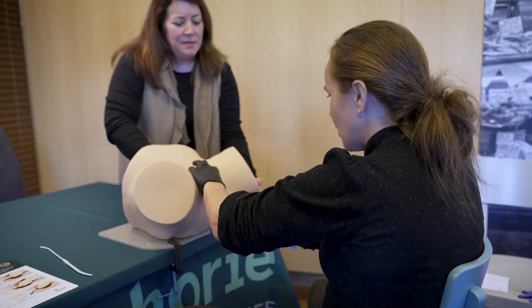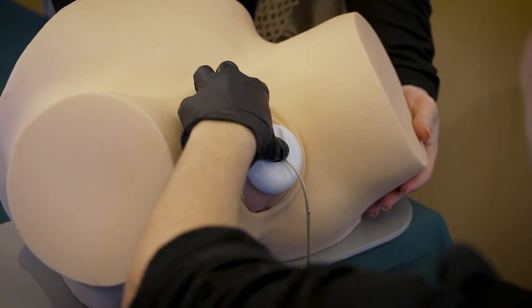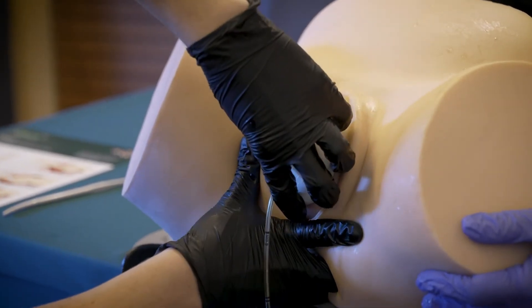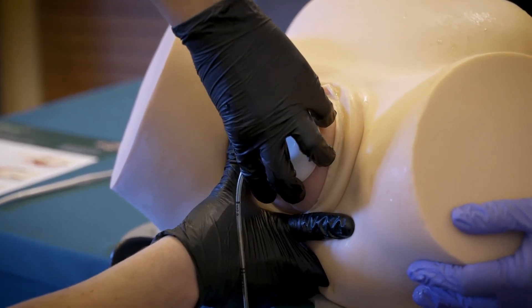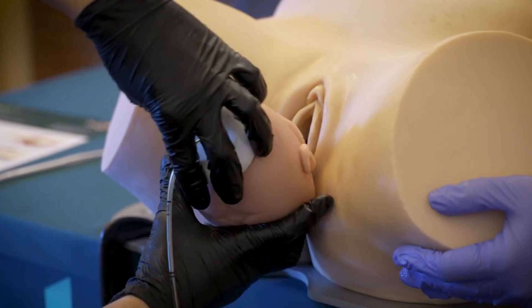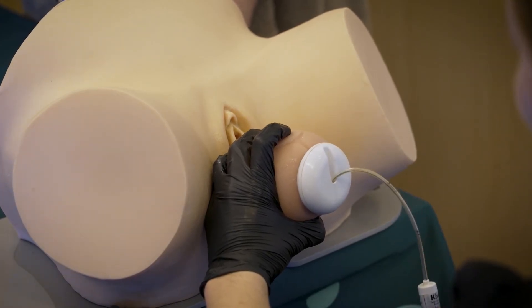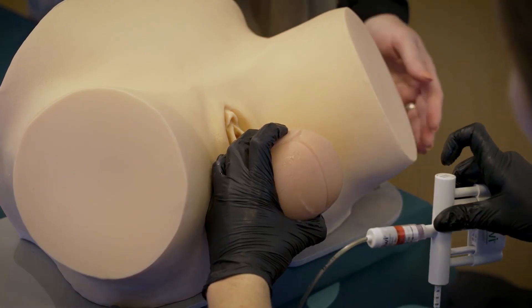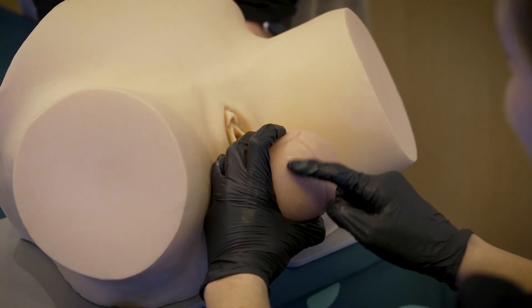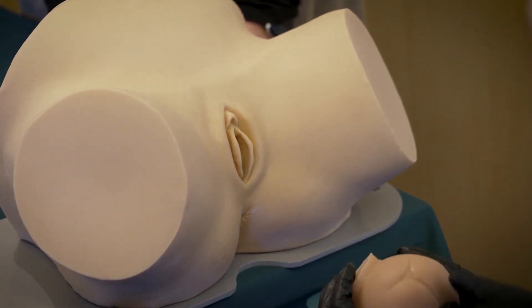With another contraction, pull again at 90 degrees. As the baby's head is crowning, assess for episiotomy — at 60 degrees if necessary — with a low threshold for a first vaginal birth. Perform manual perineal protection: dominant hand supporting the perineal tissues, non-dominant hand controlling the speed of delivery of the baby's head. Once the head is delivered, release vacuum suction by pressing the vacuum release button. Check where the cup was placed on the baby's head — in this case it was placed correctly over the flexion point — then deliver the rest of the baby as normal.